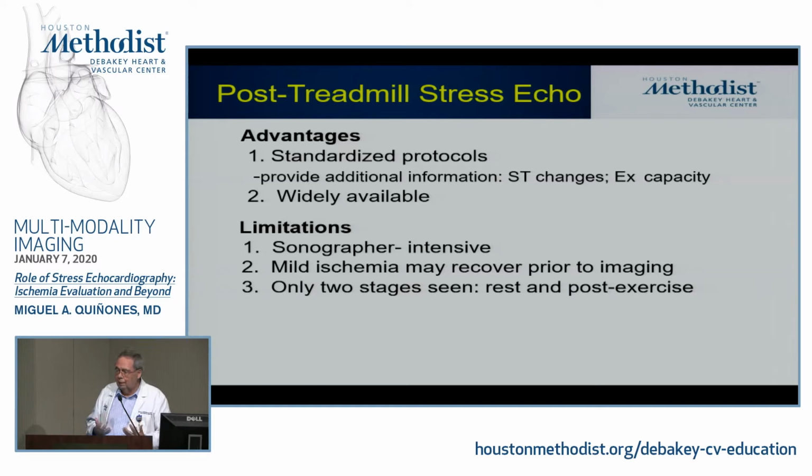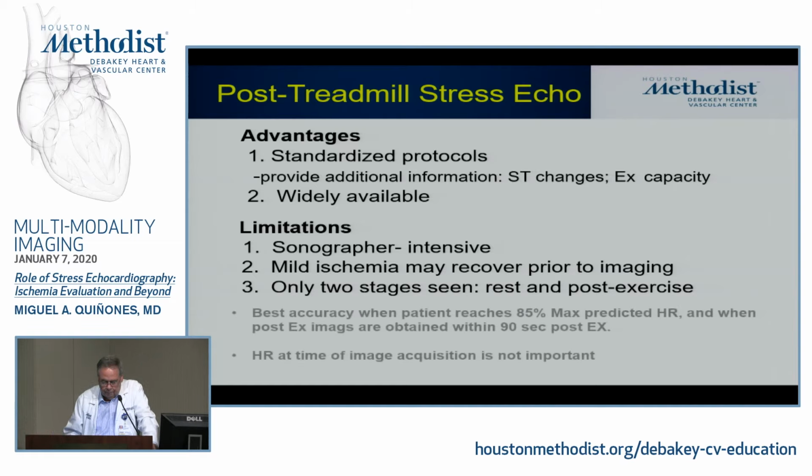But since you don't know that information, it is so crucial that you get everything done within 90 seconds, and of course, if you get it within 60, that's even better. That's why, truly, in an echo lab, treadmill stress echo should be done by the most experienced sonographers. You do not put a new rookie to do stress echoes on a treadmill. You start them with Dobutamine, which is very easy, more relaxing, and then as you learn your way, you get into doing it with the treadmill.